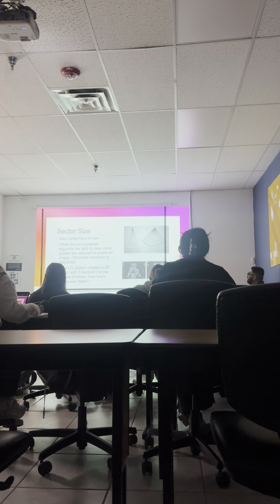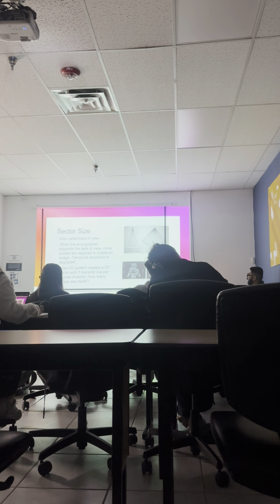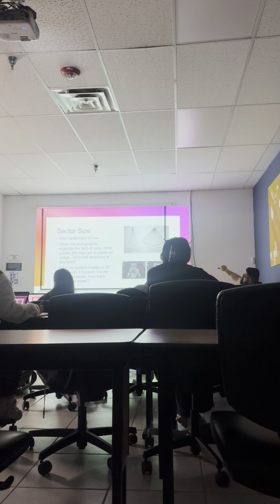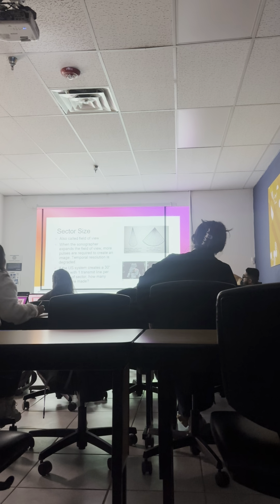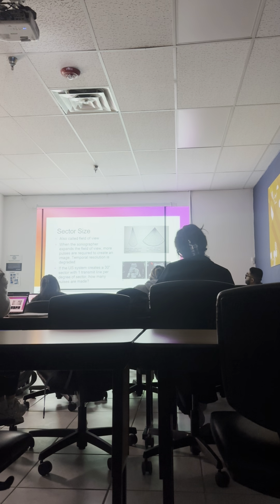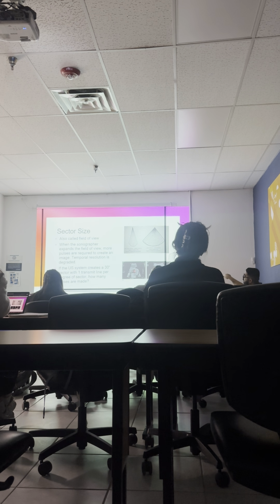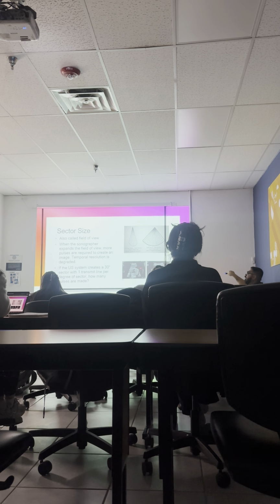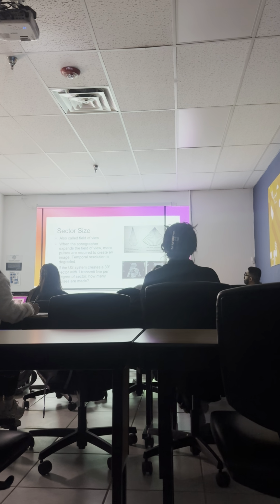Okay, so what's this right here? A circle, yes, very good, it's a circle. It's a circle with some black and gray stuff. Okay, so this is a transverse view of a fetus. Okay, so these are the ribs, this is the heart, and this is edge shadowing by the ribs. Look at the difference between how the heart looks here and how the heart looks here. Do you guys see the difference? We could actually see the valves within the heart. We could see the hyperechoic septums of the heart, right? And in this one, we could kind of see the outline of the heart, but we really can't see anything, right?